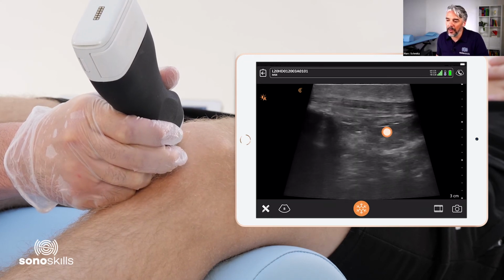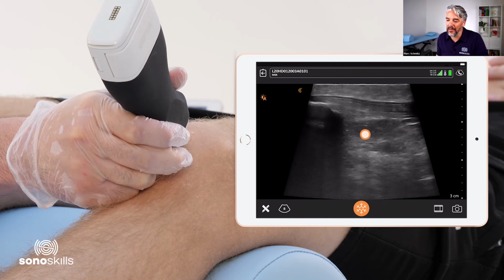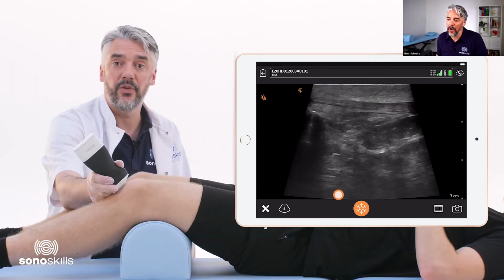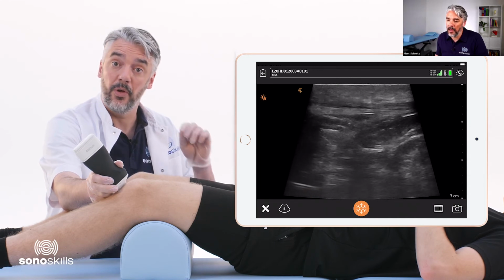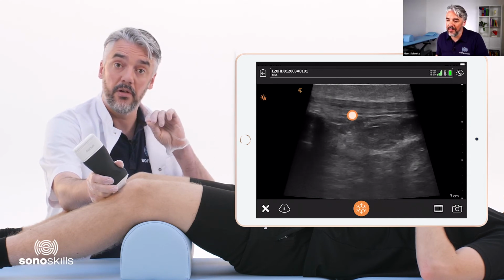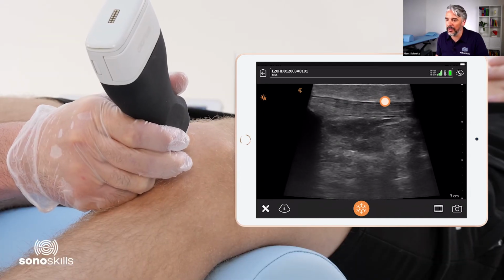Underneath the tendon, we can observe a fat pad. This is indeed Hoffa's fat pad. And in the very depth, sometimes you see a glimpse of the femoral condyle right there. That's the femoral condyle. So what we do want to see is that the tendon is a horizontal line in the depth, also fairly horizontal at the top.